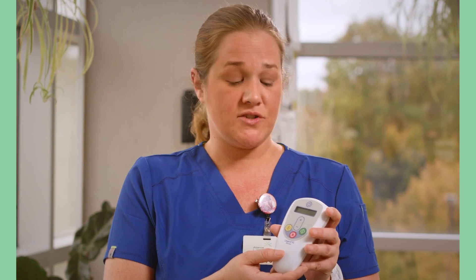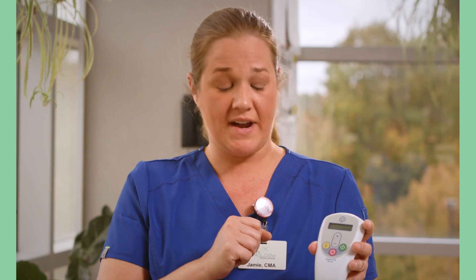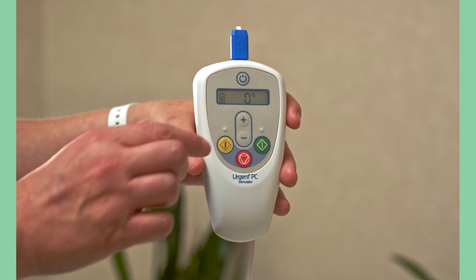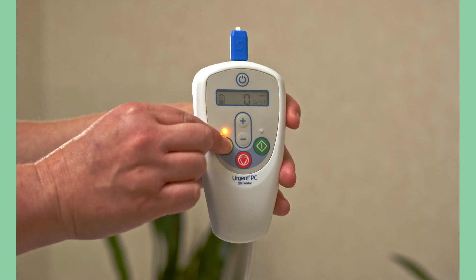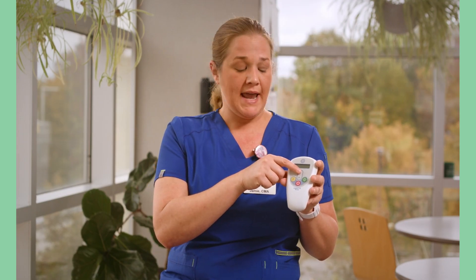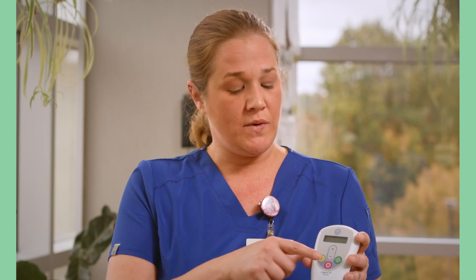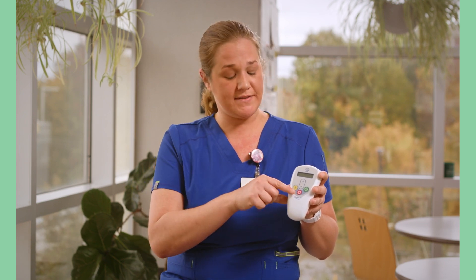Once you have the patient seated and comfortable, go ahead and turn on the device by holding the top button for two seconds. Once the device is turned on, press the yellow button, which goes into test mode. To increase the electric stimulation, hit the plus button; to decrease it, hit the minus button. Once the patient indicates they're getting a strong amount of electric current, hit the green button to enter therapy mode. If you need to stop the treatment at any time, hit the red button and that will stop delivering the electric current.